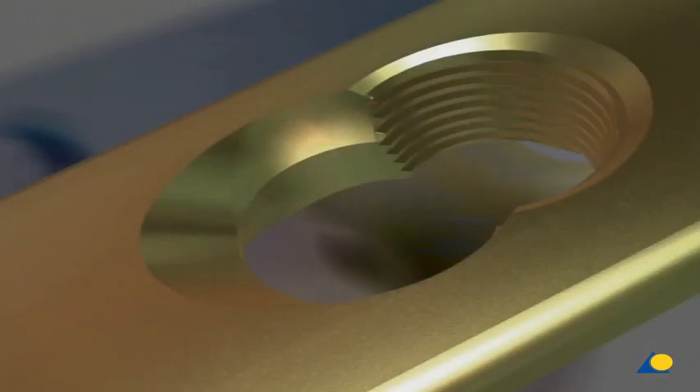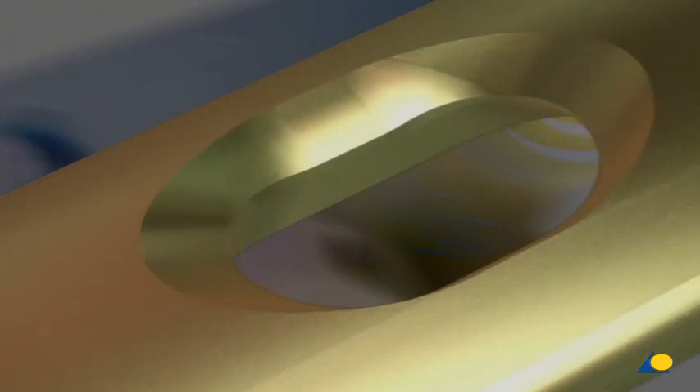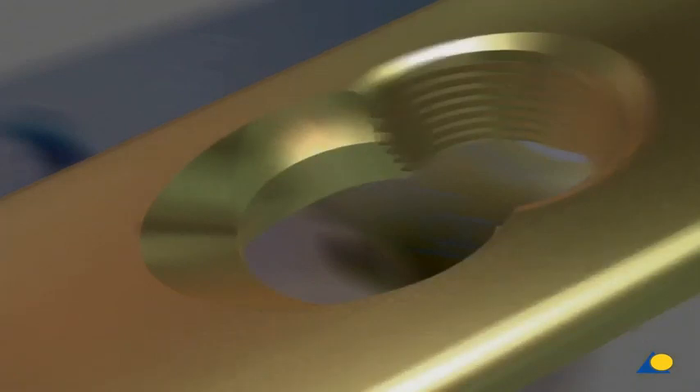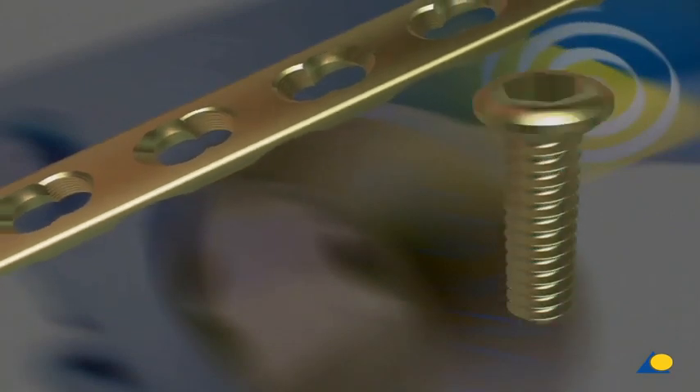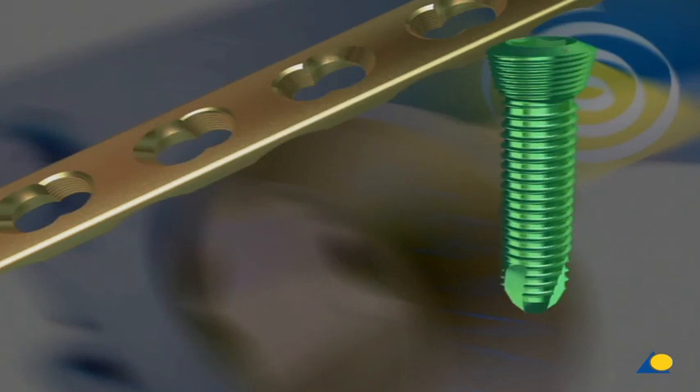The combination hole of the LCP allows the insertion of standard screws as well as locking head screws. The dimensions of this newly designed hole are similar to those of the compression plate hole. The LCP hole is divided into two parts: the dynamic compression part accepts both cortex and cancellous bone screws, while locking head screws are locked in the part of the hole with the conical thread.